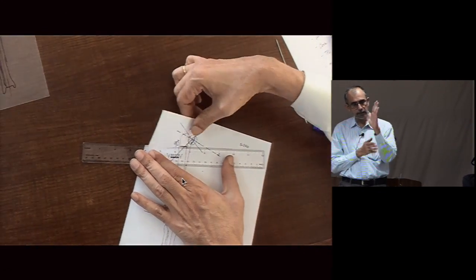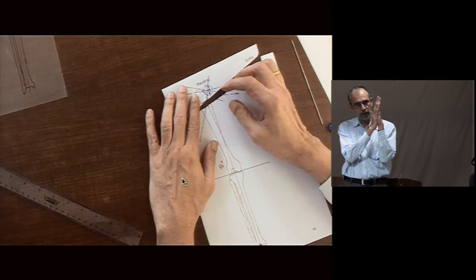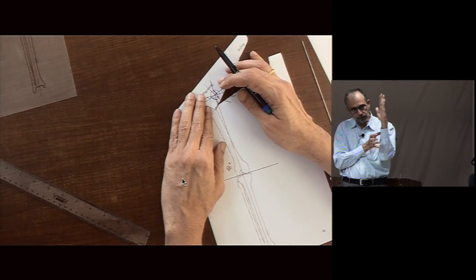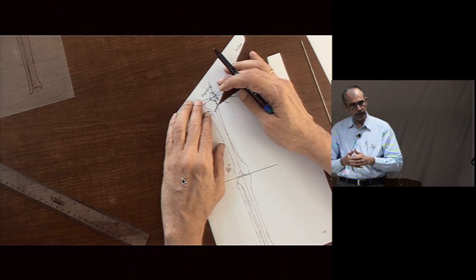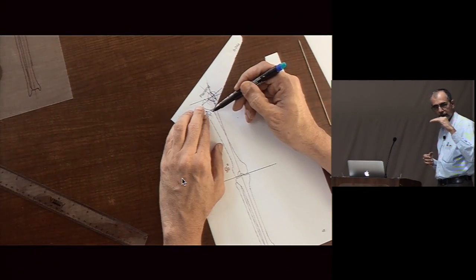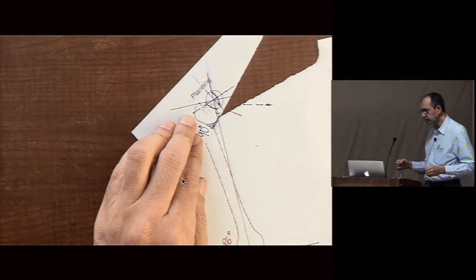If your lock plate was meant to be standing away from the bone and you pull the bone to the lock plate or push the distal fragment to the other side, the same issue happens. So it's an issue of wrong insertion of your original implant, right.